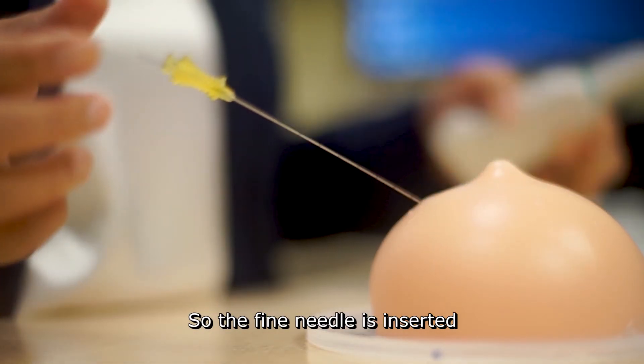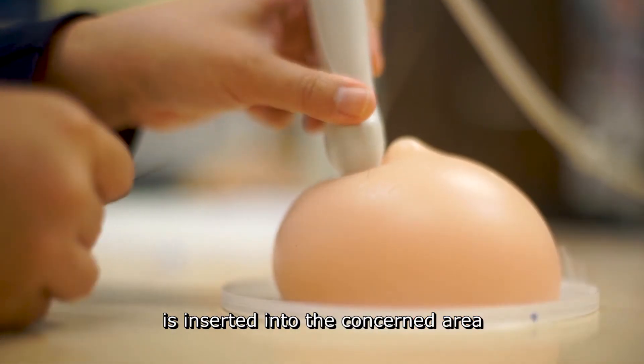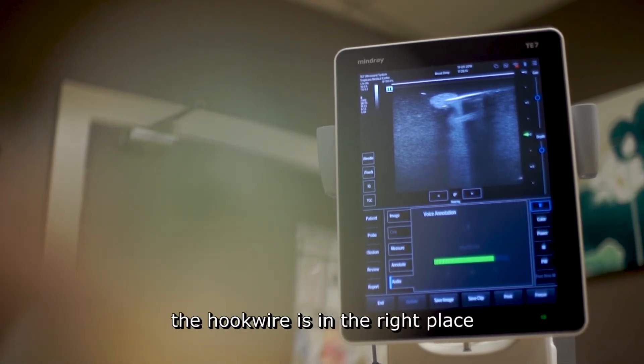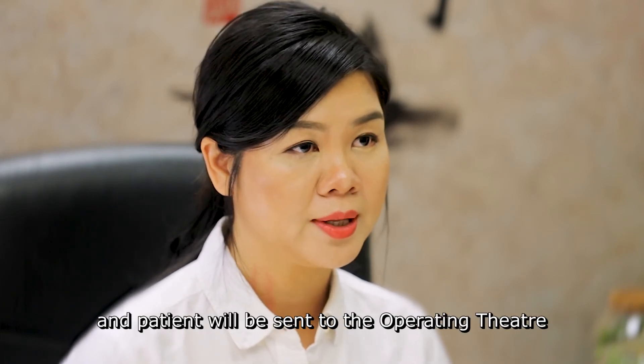The fine needle is inserted under ultrasound or stereotactic guidance, and the hook wire is inserted into the area of concern. After that, the radiologist will double check to make sure the hook wire is in the right place. Then the hook wire will be taped to the breast and the patient will be sent to the operating theater.